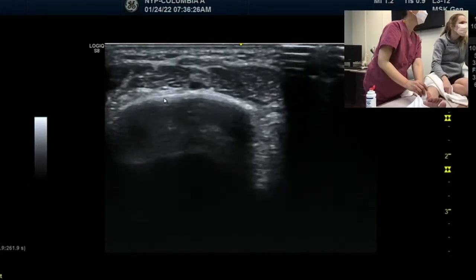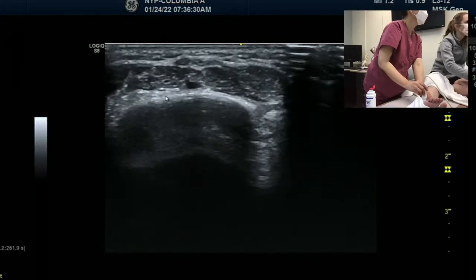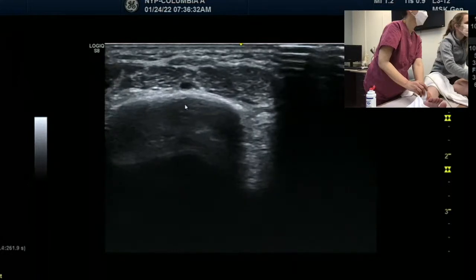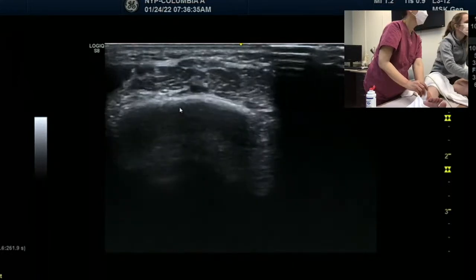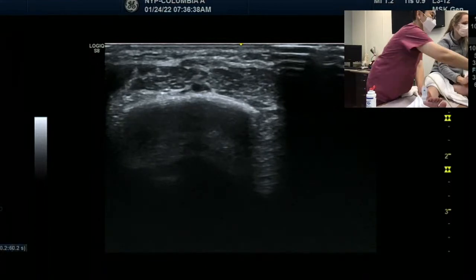So this is above the cursor, that's the deep peroneal nerve, and those are the pads over there. We should do, can you freeze? Or let's make it a little bigger and freeze.